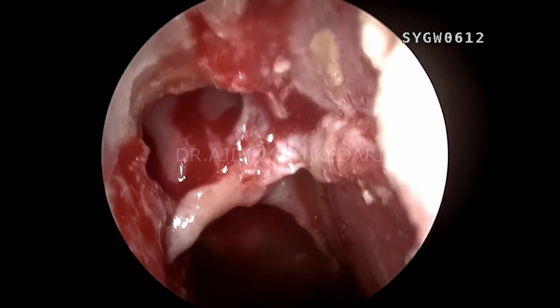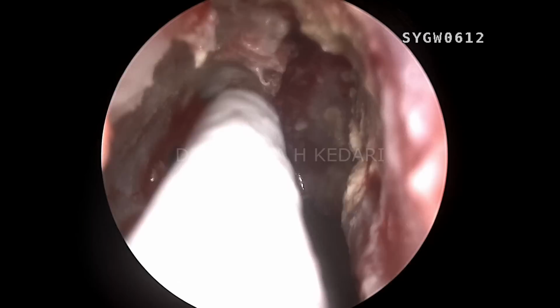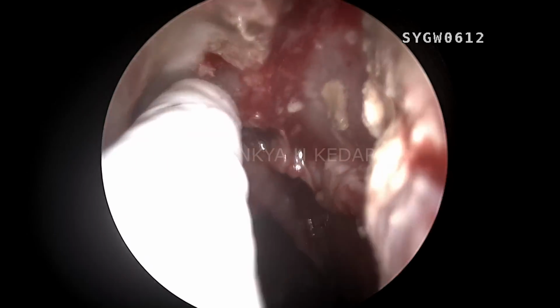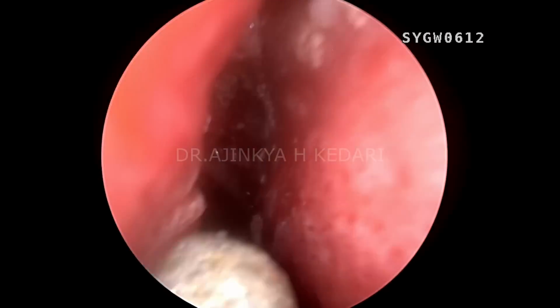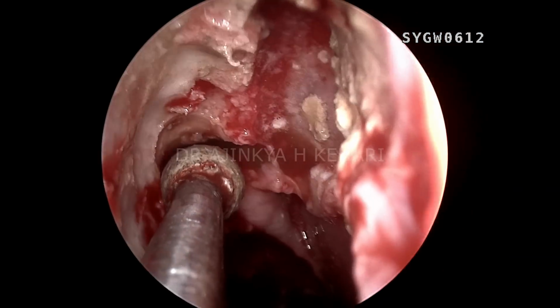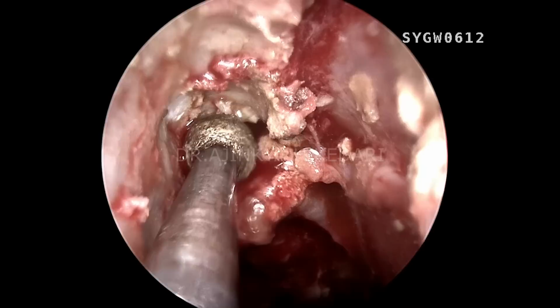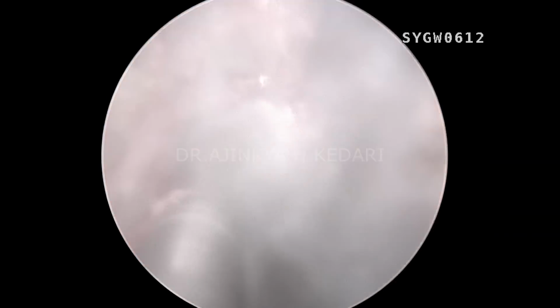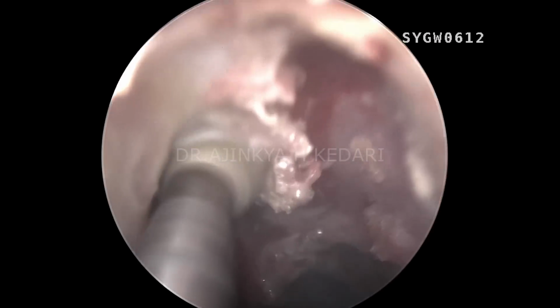So always keep the first olfactory neuron under vision so as to not injure the cribriform plate. That's the first olfactory neuron right there. So anything anterior to it, midline, lateral, you have to drill so as to open up the frontal head on. So you can see I'm going anteriorly. That's the frontal beak that I'm drilling right now. So once you take away the frontal beak entirely, you'll be having a head-on direct approach to the frontal sinus.